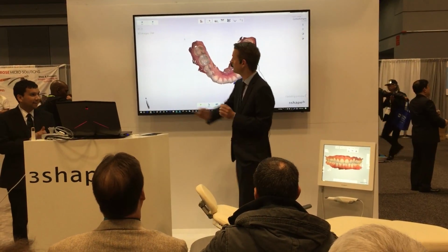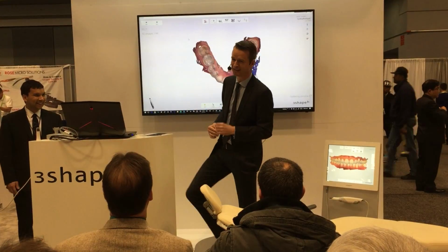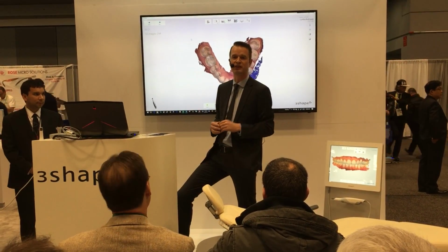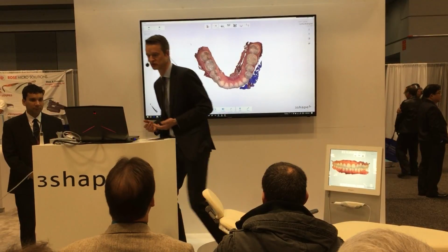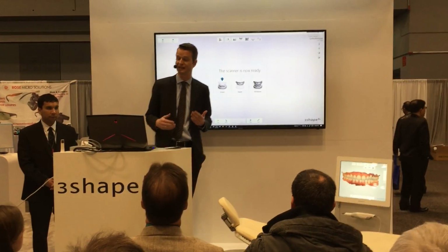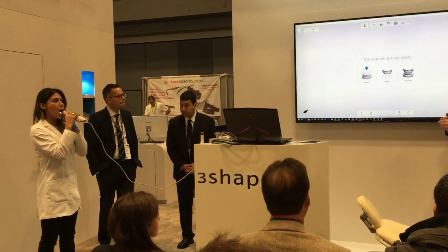So pretty impressive, 20 seconds. I'm personally on 30 seconds, so I'm a little bit disappointed she's faster than me. But even you guys that are signing up for 3 years, I'm sure you will consistently be able to go below 1 minute also as a general user, with a little bit of experience, of course. So we are just going to show you how fast it is actually to scan a quadrant also, because in many cases, like if it's just a single crown, you will just scan a quadrant. And you see again how we scan.